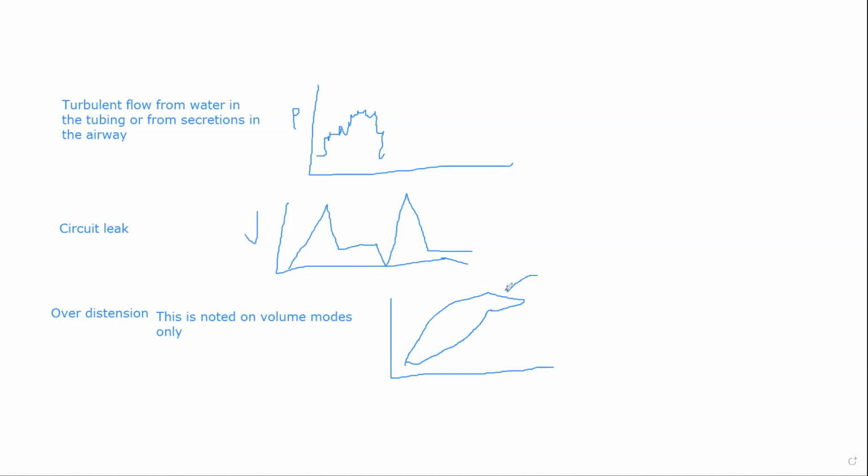So that extra pressure stretch, when a little bit of tidal volume is going in, it's called beaking, I guess, or over distension. Yes. Duck beak on a hysteresis curve. Can you see this? Will this show up in a pressure mode or PRVC? No.